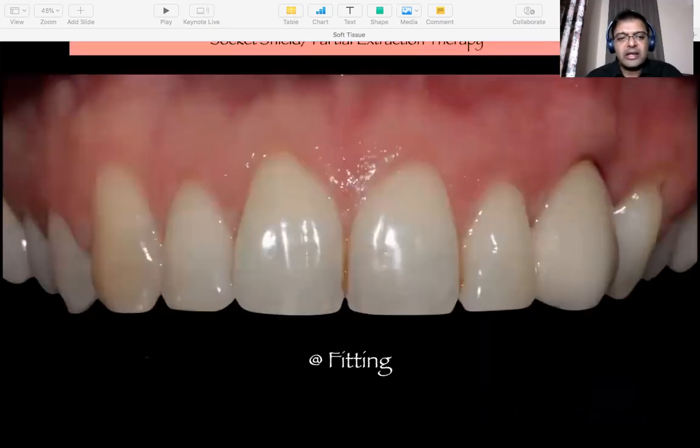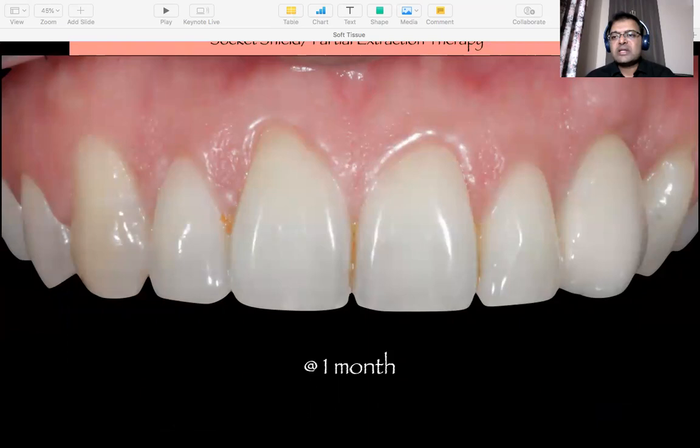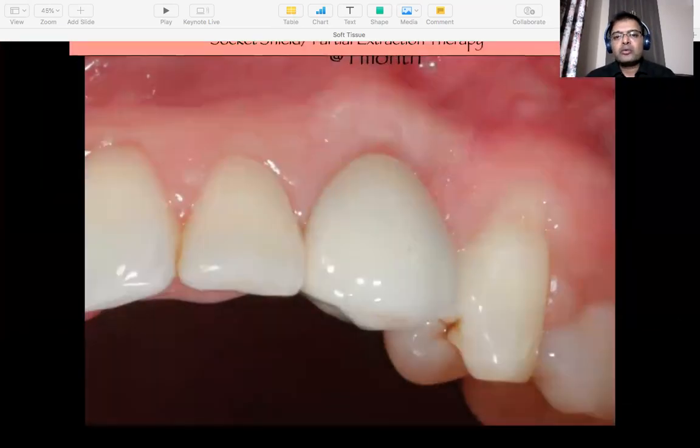And that's why I get the best possible outcomes here. So the gingival zenith on 2-3 is as good as that on 1-3. The emergence is wonderful. The peri-implant tissue health is fabulous. And that's what I want. What I see is what I get. I want to see a beautiful contour, a very healthy tissue. And what I did, as a clinician, was actually not do anything. I just did not touch the soft tissue. And that's the best thing you can do. Without touching, you get the best outcome.